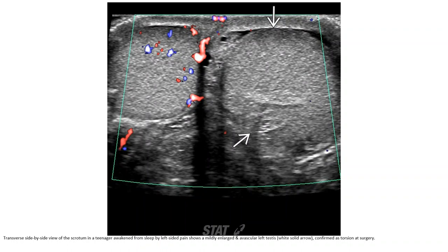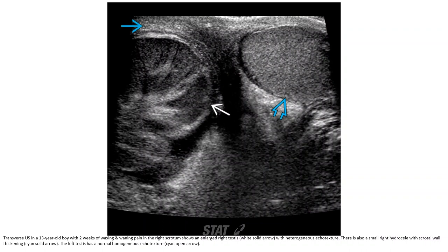Transverse side-by-side view of the scrotum in a teenager awakened from sleep by left-sided pain shows a mildly enlarged and echogenic left testicle, confirmed as torsion at surgery. In a 13-year-old boy with two weeks of waxing and waning pain in the right scrotum, an enlarged right testicle with heterogeneous echogenicity is seen. There is also a small right hydrocele with scrotal wall thickening. The left testicle has normal homogeneous echogenicity.